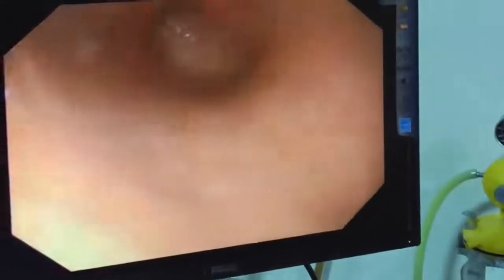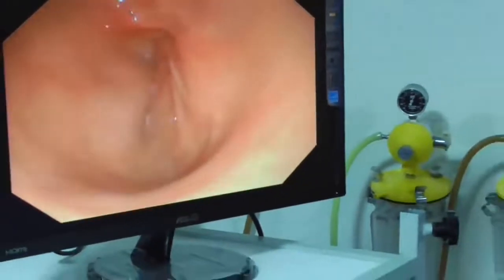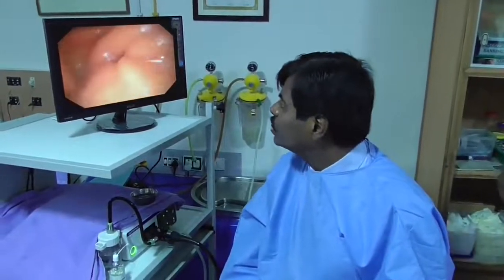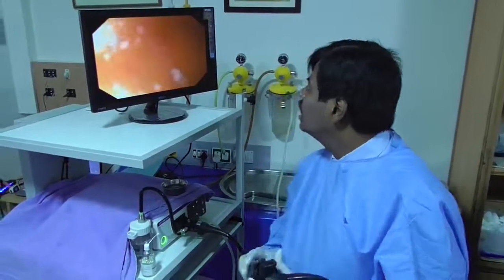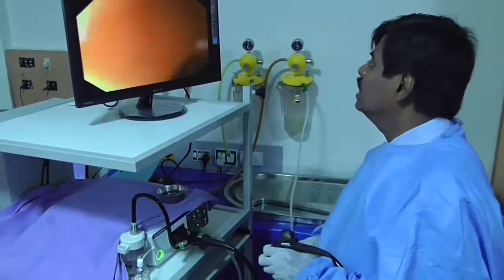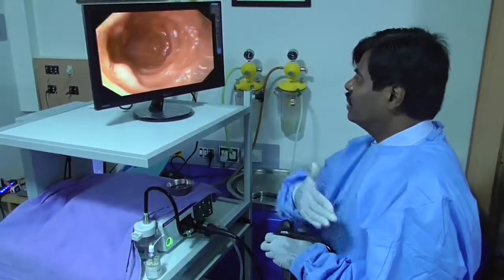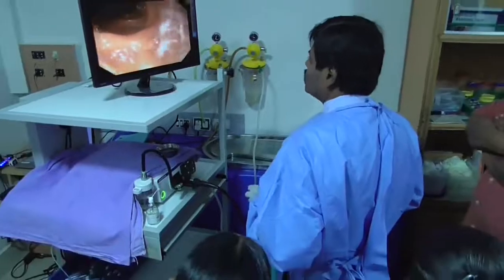We travel the long route to identify the pylorus, which is now coming into view but facing toward 9 o'clock. Ideally, bring the pylorus right to the center of the screen for easy intubation into the duodenum. Go close patiently with a gentle movement and you will be able to enter. Now the pylorus is more or less centered. You can enter the first part and then the second part of the duodenum. Notice that I have shifted from looking at the patient to looking more toward the monitor, even showing my back to the patient, to ensure the scope remains in the duodenum.